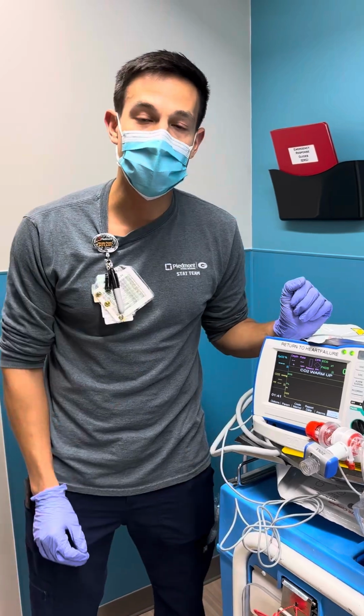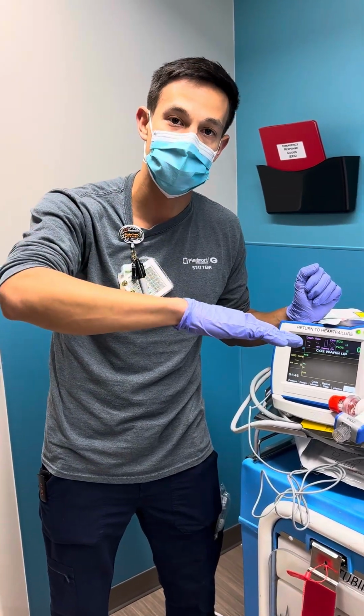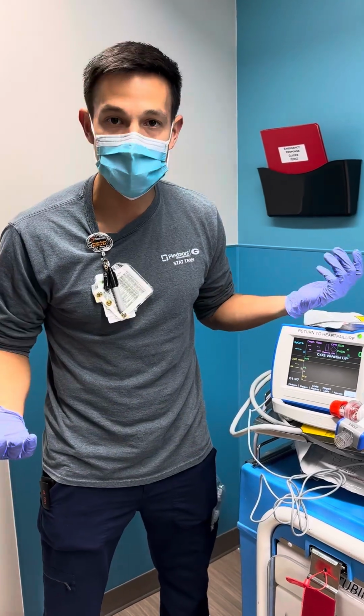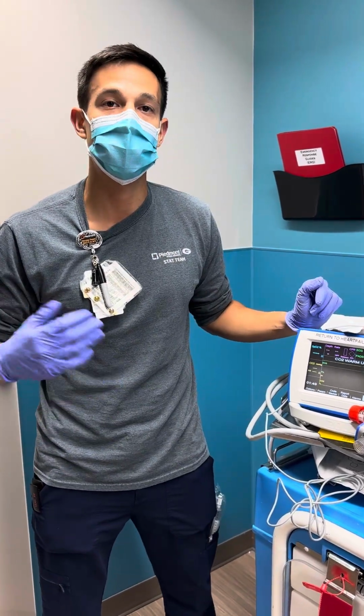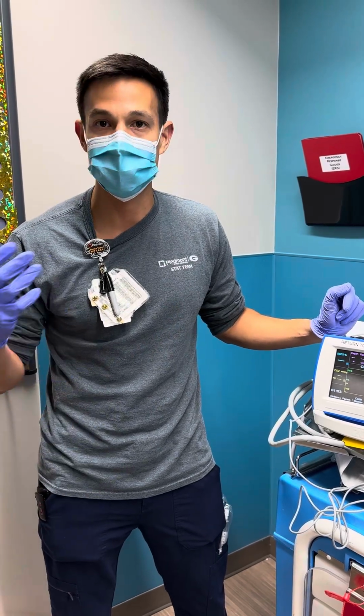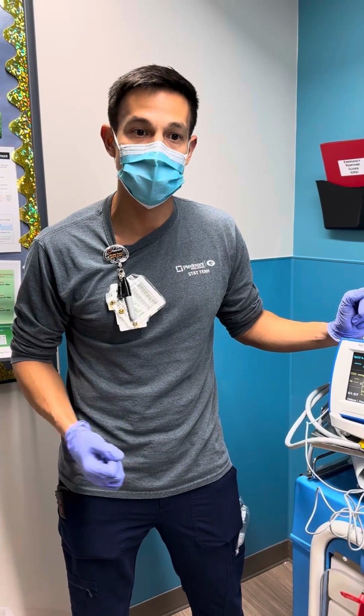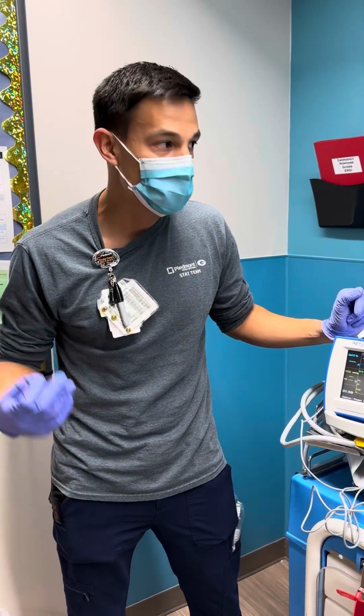What we can also see is if we see a gradual decrease in our end-tidal CO2 as we're doing chest compressions, that could possibly indicate chest compressor fatigue. So maybe it's time that we have that compressor switched out. We're doing some CPR coaching, making sure we're doing effective, high-quality CPR.